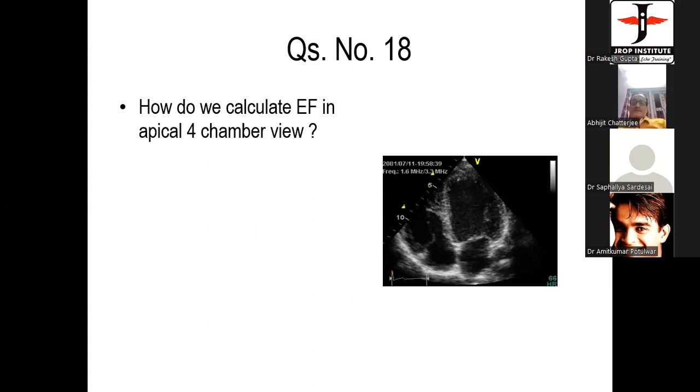Thank you, sir. Dr. Mitul Jain, can you hear me? Mitul, are you there? Dr. Namdev Limbaji. Yes, sir. Dr. Namdev, can you hear me? Yes, sir. Dr. Gupta, sir, can you show a parasternal long axis view, please?